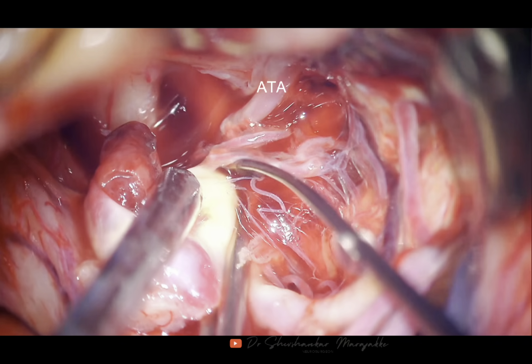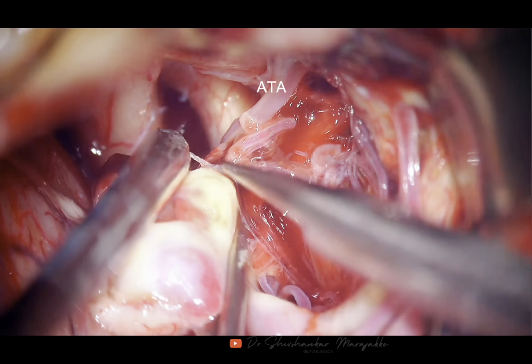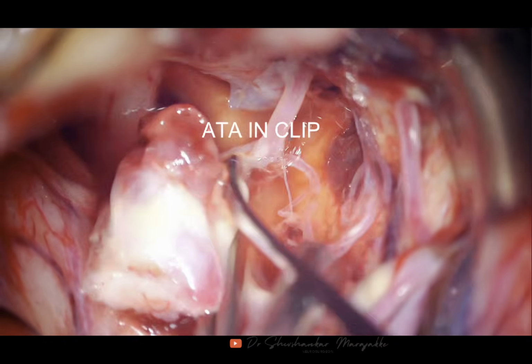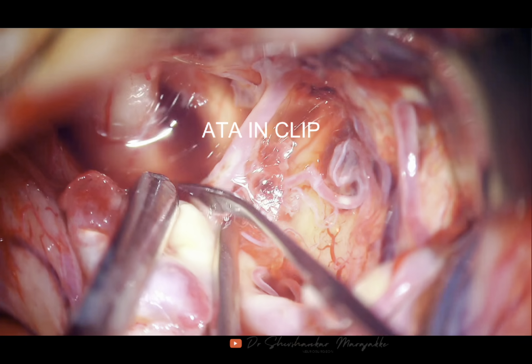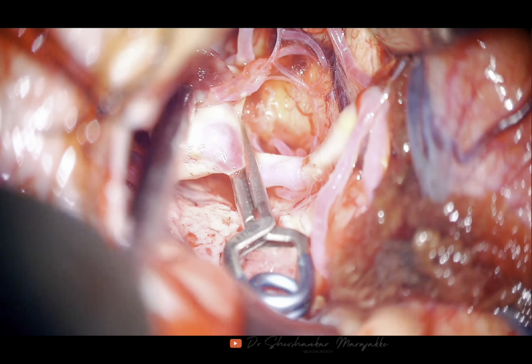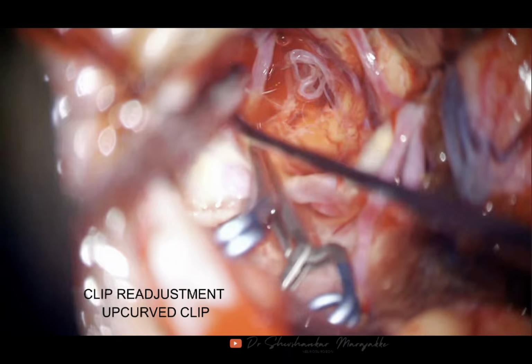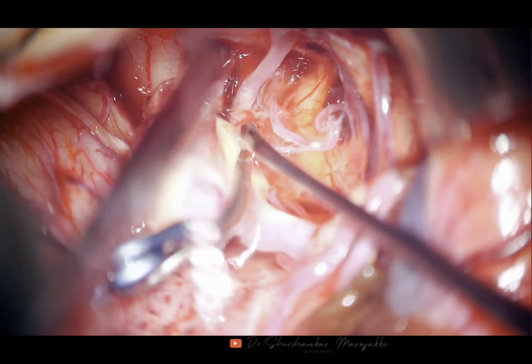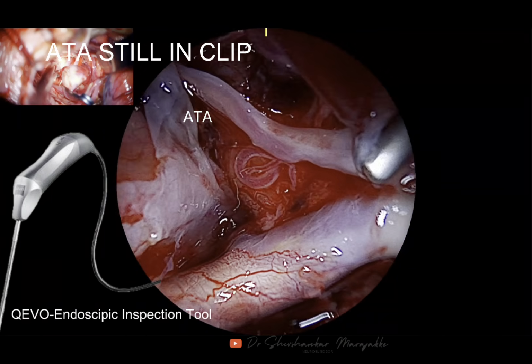So I can manipulate the fundus of the aneurysm, I can expose the complete neck, and then I can readjust my clip. So here you can see that at the neck there is a yellow atherosclerotic, probably a calcified plaque under my suction tip. That is the thing I am retracting. So that is preventing the clip from sitting in the proper position. So this is a complete exposure, and I want to readjust so that I can save the antetemporal artery and completely occlude the aneurysm. So I use the upcurved clip so that I will avoid catching the antetemporal artery.